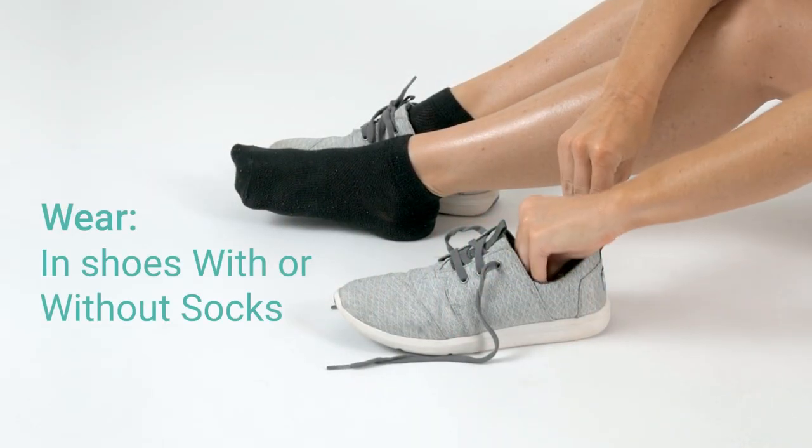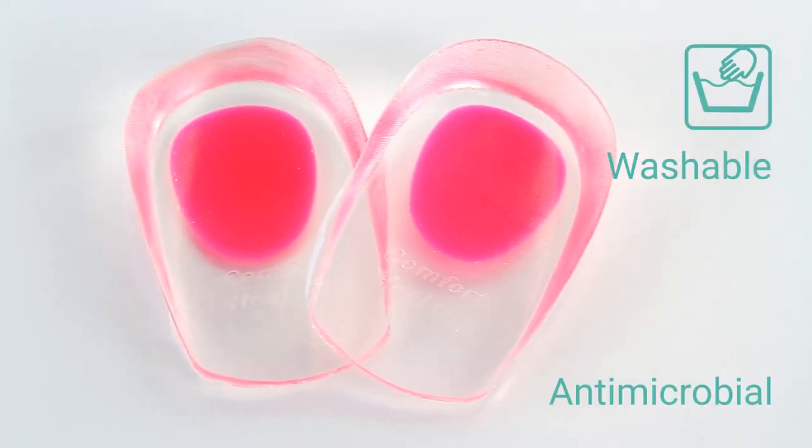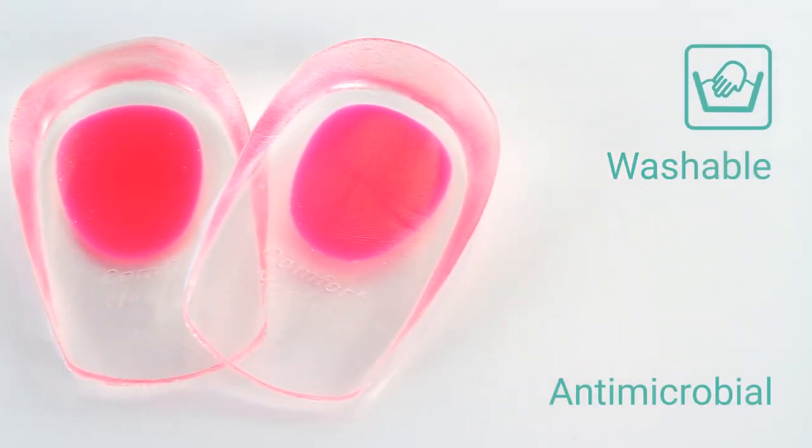Cups can be worn in most shoes with or without socks, or inside socks if desired. Washable antimicrobial material prevents bacterial buildup and odors.